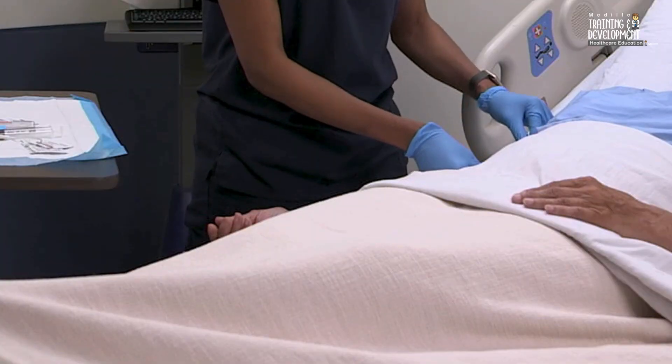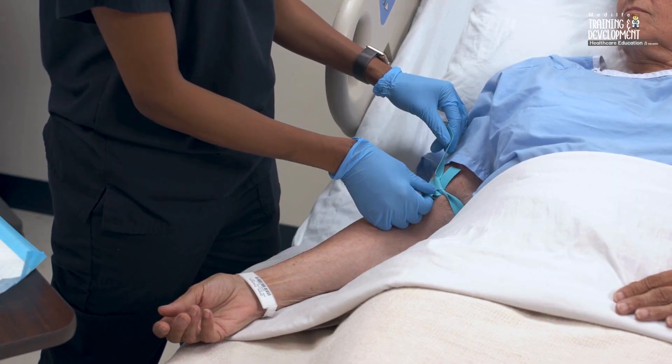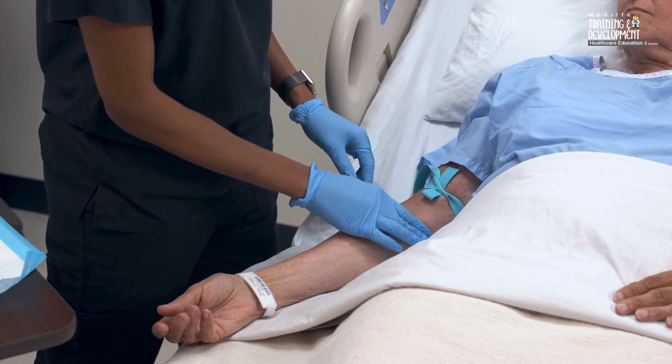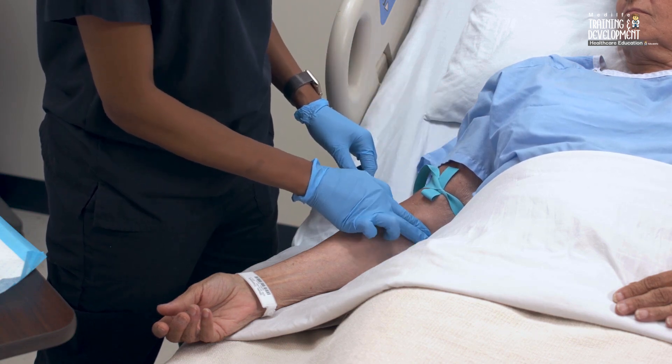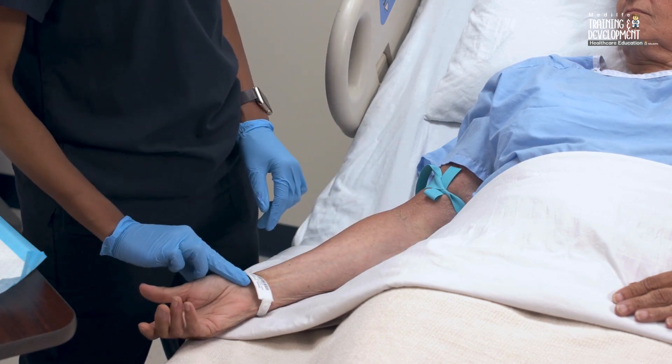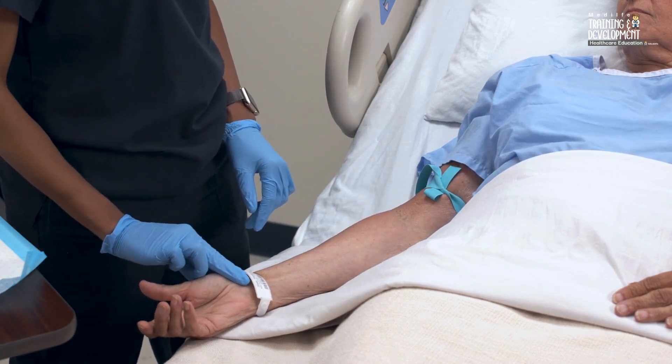Apply a tourniquet about 2 inches or 5 centimeters above the intended venipuncture site to accurately identify and prioritize the veins for use, in order to minimize potential for injury and complications. Make sure you can palpate an arterial pulse distal to the tourniquet to prevent circulatory impairment.